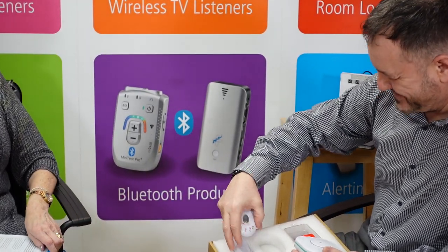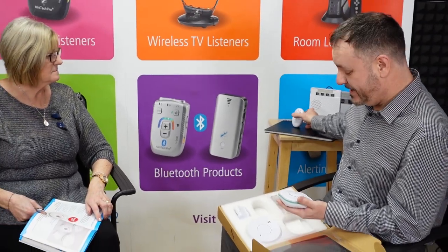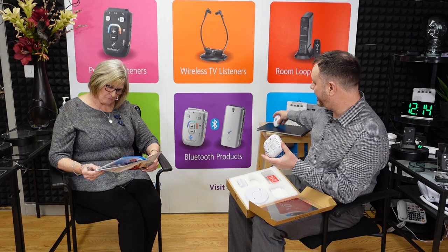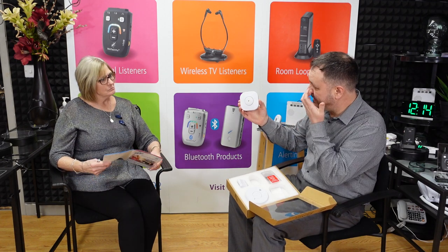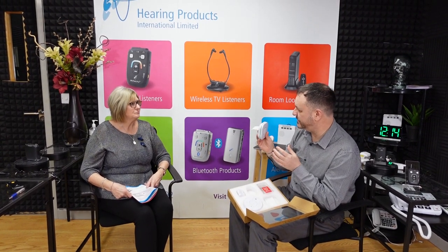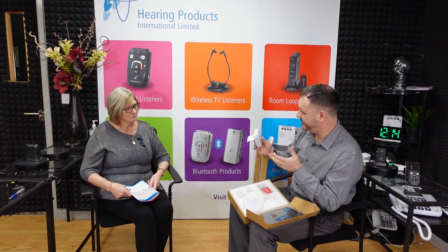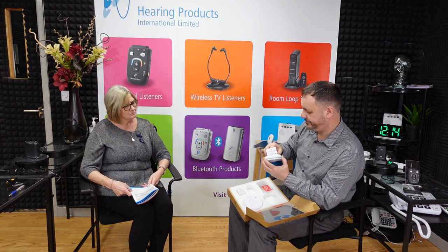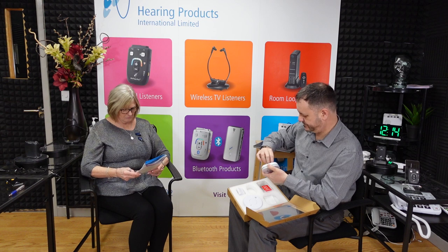The sound sensor has three sensitivity settings. Exactly the same as the pager, it has a two-year battery life. You can change the batteries yourself once they've run down — they're two double-A batteries. Because this is a safety unit for the home, one important feature is that if you remove the battery from this unit it actually won't close, so you can't attach it to the wall without the battery installed.